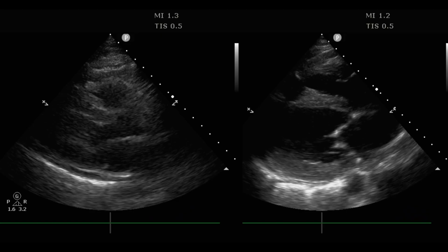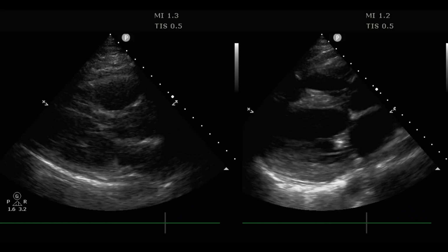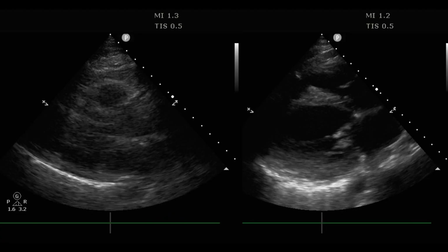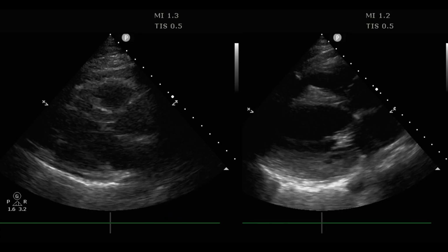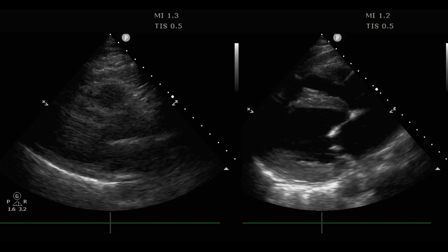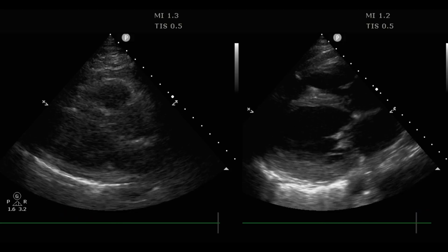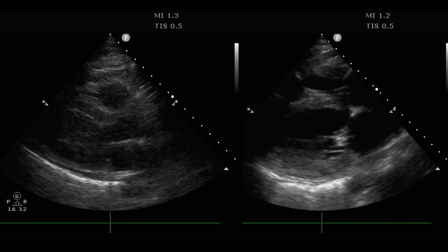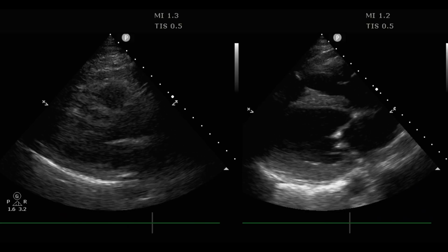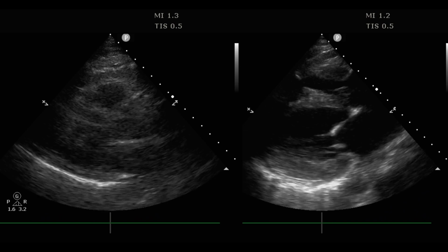And I've been doing a particular focus on the QA recently on cardiac ultrasound in our emergency department, to see how accurate our EF assessment is compared to an echo that's done next day. And in certain cases, there is a little bit of a discrepancy of what we may call and what's officially reported out. And a lot of these, it's those in-between cases. Some of them, I look at it and it's okay, there's an issue we have to rectify here.